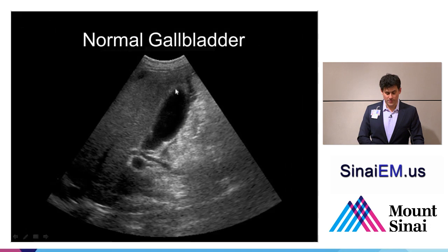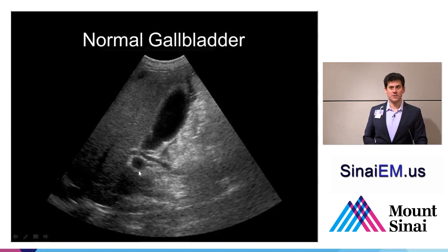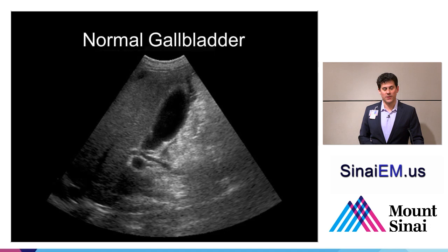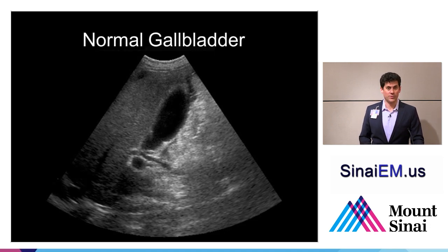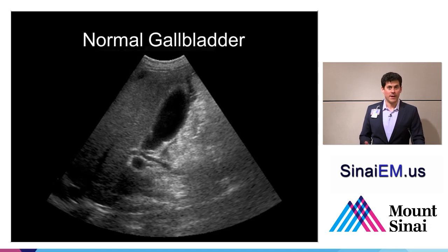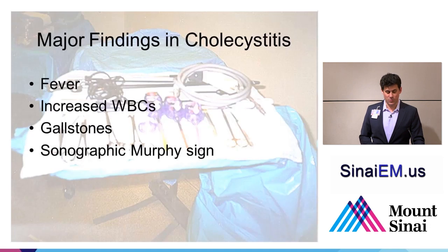Here's another normal gallbladder demonstrated longitudinally with a portal vein below it. There can sometimes be confusion with respect to terminology — long and short axis, transverse, longitudinal. When people speak about the gallbladder, they're typically speaking about the orientation of the gallbladder itself. A long view of the gallbladder is one where you can see the fundus all the way up to the neck down into the portal vein. A short view is basically a transverse cut through the gallbladder.